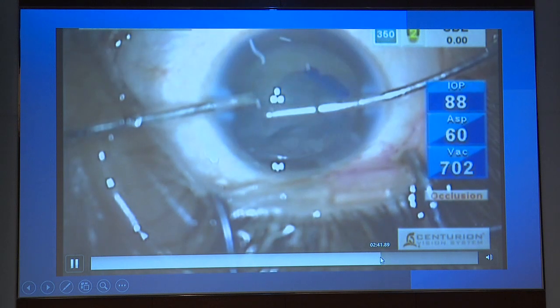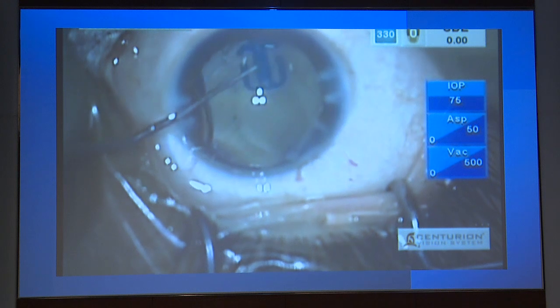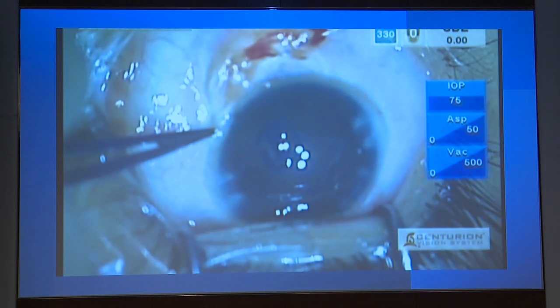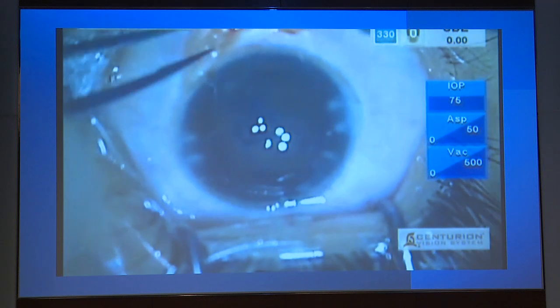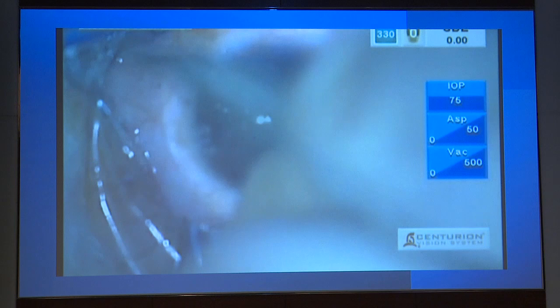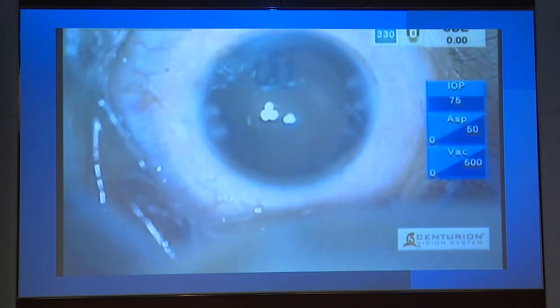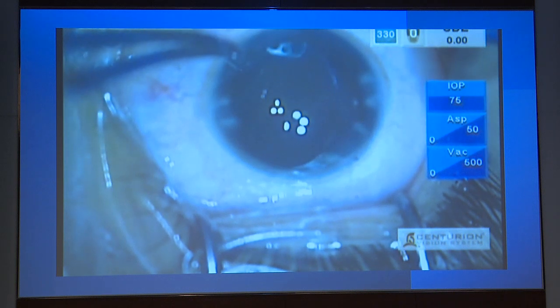After that, we can do a slow insertion, the anchor being held by its two trailing legs, and then engage the capsular bag with the ASIA anchor. Adjust the suture tension. Then we lock the suture in place by passing this needle twice through half thickness of sclera. So that's once. Once you tighten the suture after passing it twice through half thickness of sclera, you simply tie it tight. This gives you a good capsular bag with adequate tension, which will hold an IOL. It gets buried inside the sclera itself.